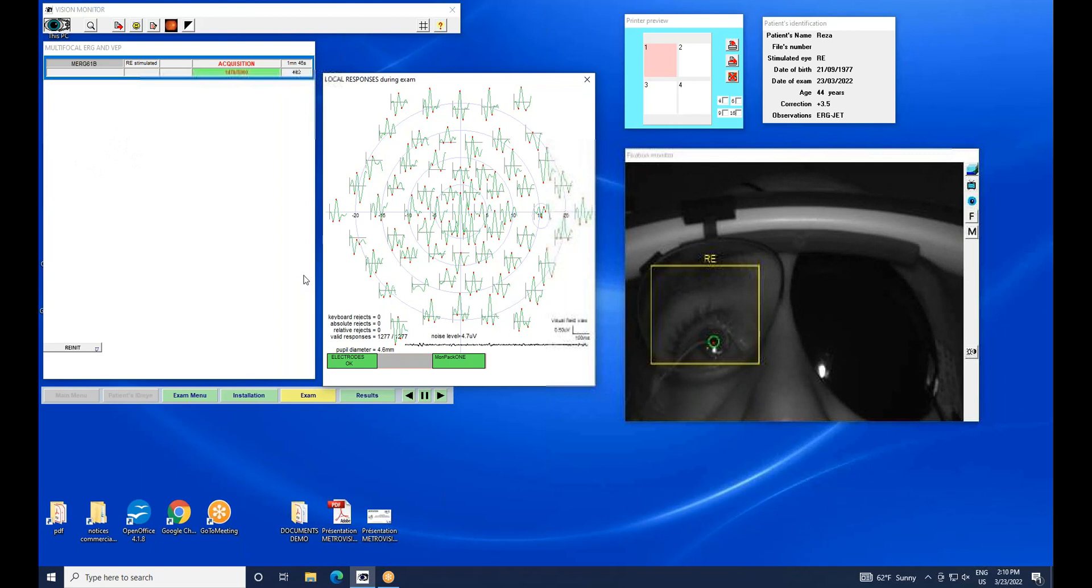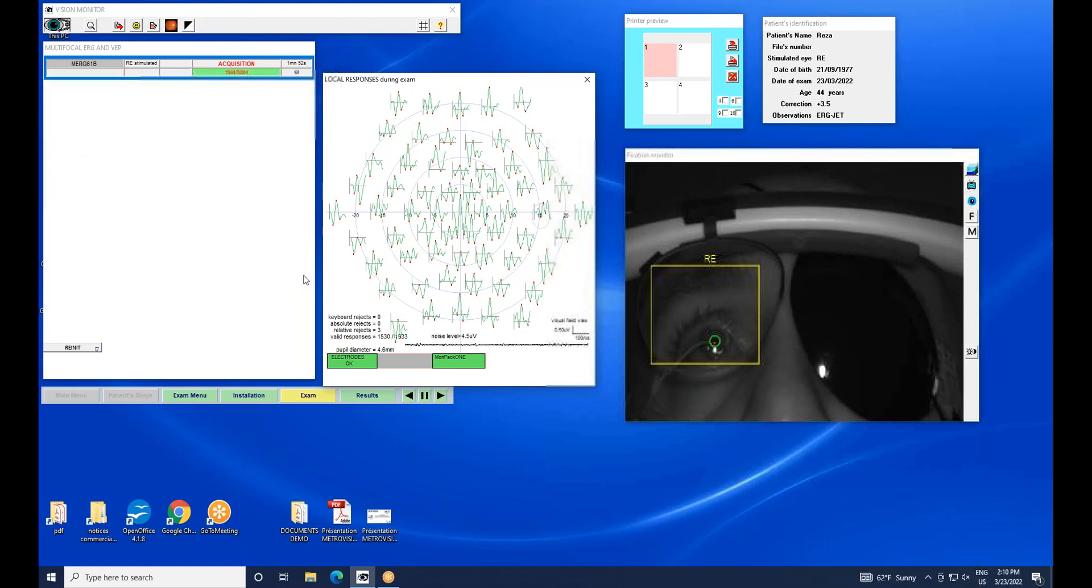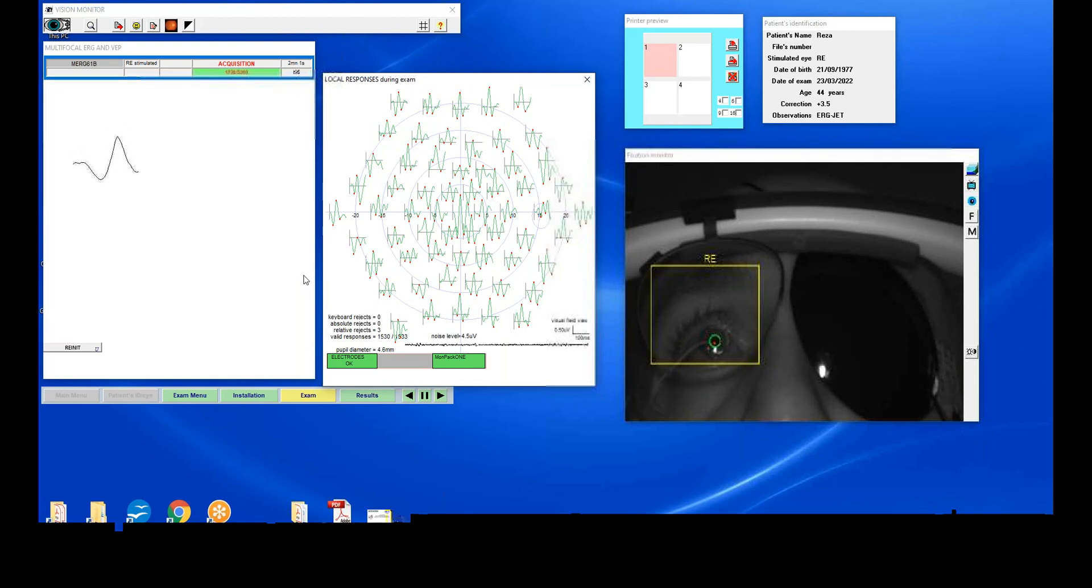High noise level is usually due to eye movements, eye blinks, or unstable electrodes. With a good subject, I reach a sufficiently good noise level after about one minute of recording time.